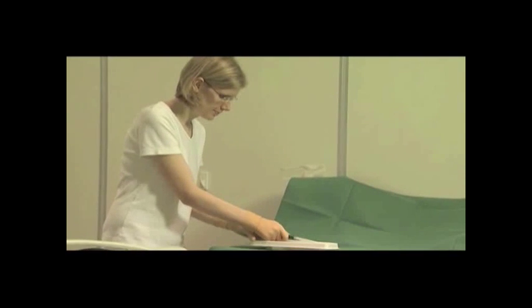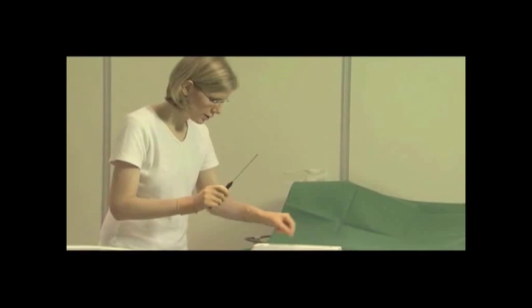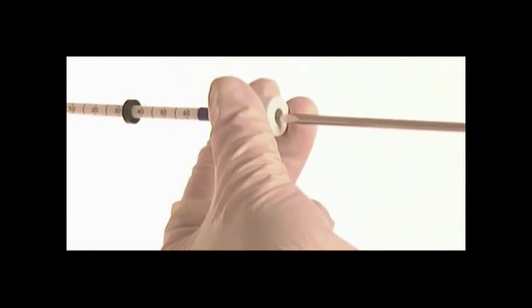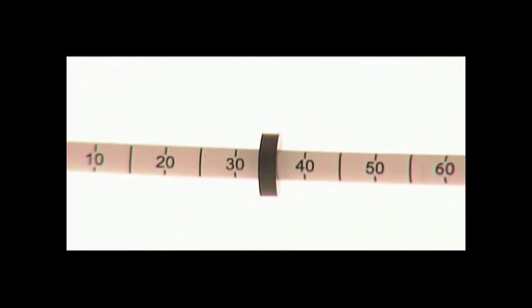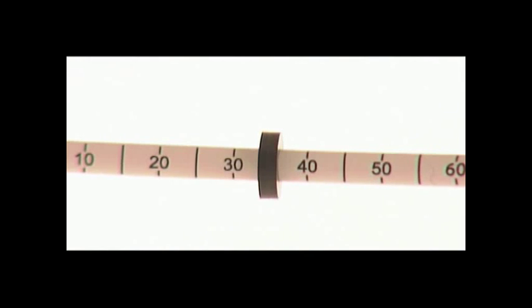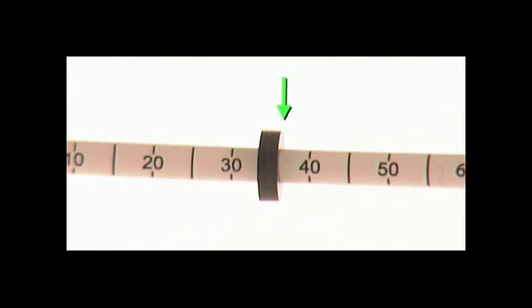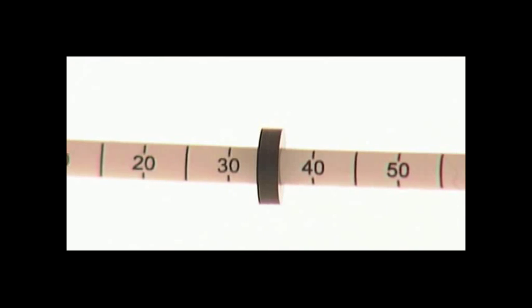Remove the remaining contents of the introducer localization set. Place the introducer stylet into the introducer sheath. Adjust the depth stop on the introducer sheath to the calculated depth of target, reading the depth from the side distal to the patient.